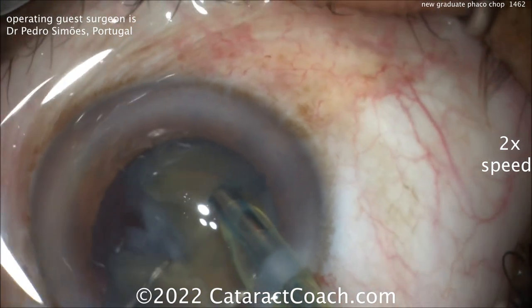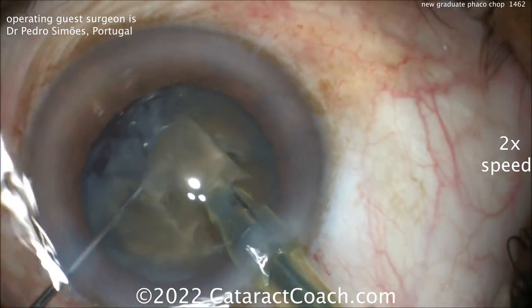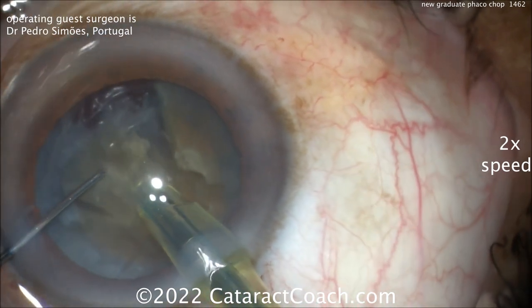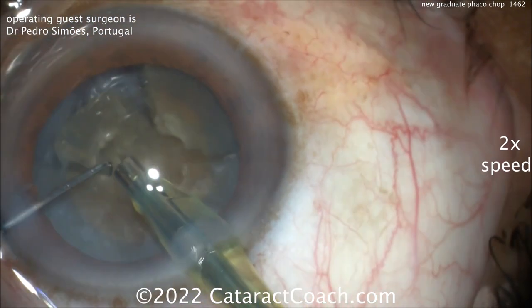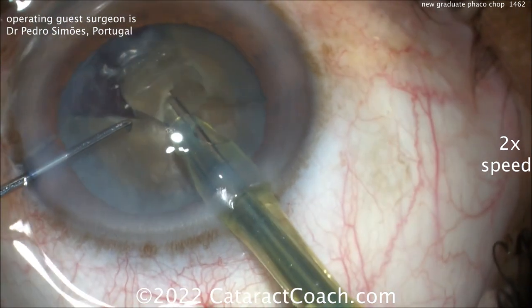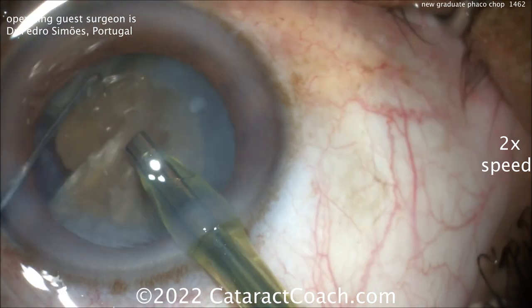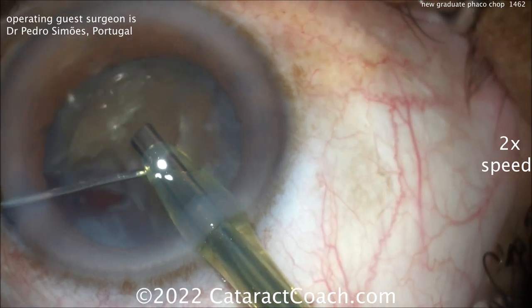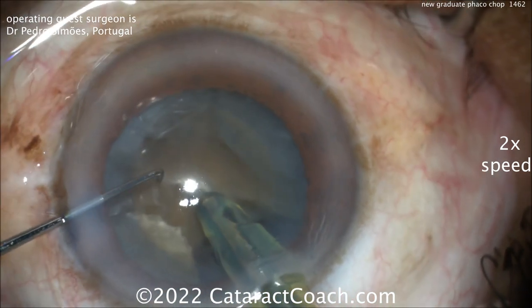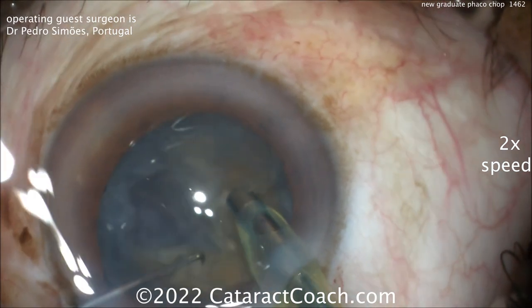Now more of a horizontal chop getting around the lens equator there. Notice how they're still kind of connected on the back, so chop off a small fragment — that's about an eighth of a nucleus. You can try the other one as well. In a case like this where it's very dense, you're going to get those fibrous attachments on the posterior plate. Now look at the eye position — I'd like a little more effort to keep the eye back in primary. See the three light reflexes from the microscope? You want those basically in the center of your cornea the whole time. So rotating the nucleus, Faco probe going in, chopper going around nicely around the equator — horizontal chop. Beautiful technique.